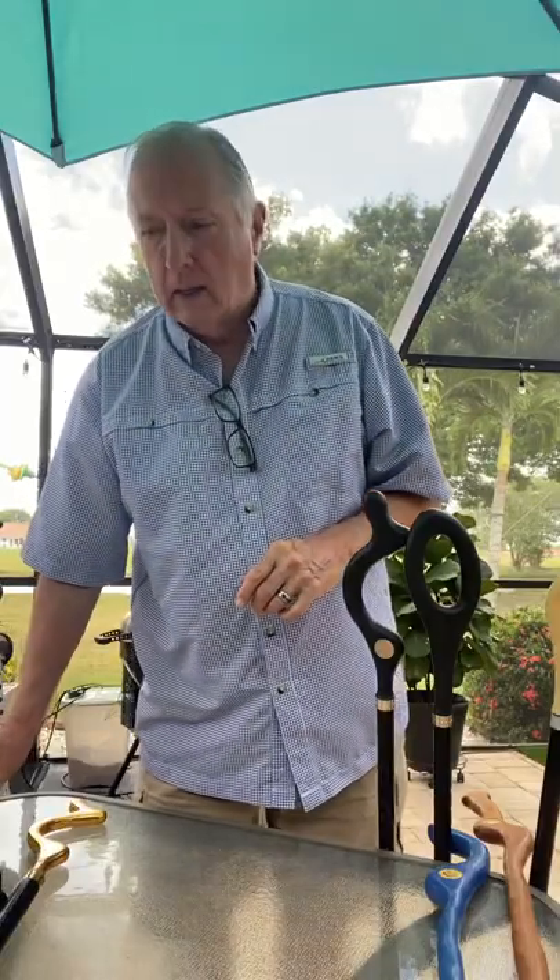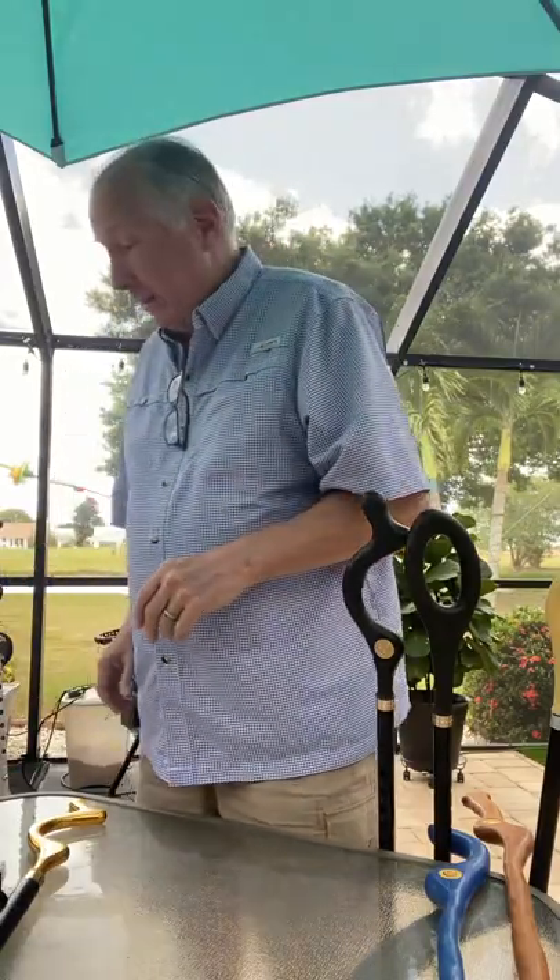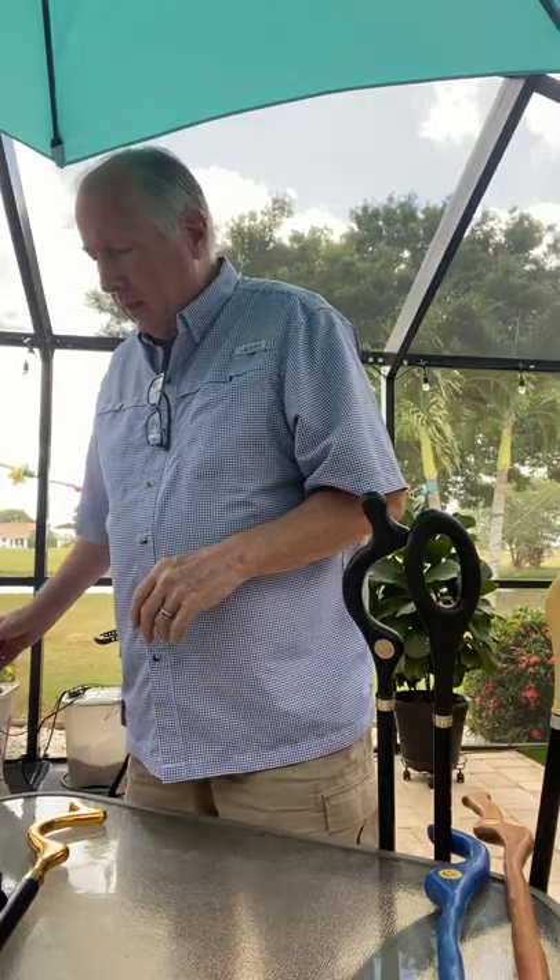Hi, I'm Ron Campbell, the inventor of the posture cane, and some people call me the eccentric inventor, I guess. Anyway, what I want to talk to you about today is regular canes and the posture cane and the difference in terms of biomechanics.